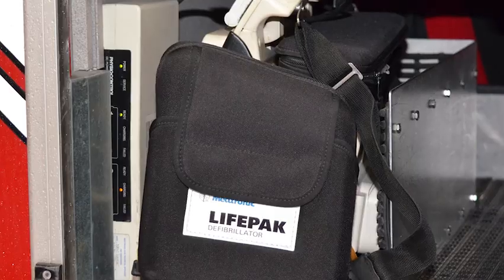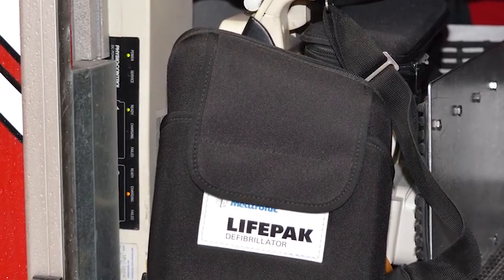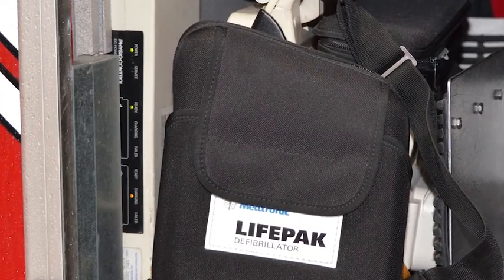Now we're going to talk about the batteries for the LIFEPAK 15 and the charging unit. I'll show you in just a little bit what the desktop charging unit looks like that will be located at all the stations. One of the things that will be a change for us is doing away with the onboard charging systems that we're so used to. A number of our neighboring agencies, including King County Medic 1, currently use the lithium-ion batteries on the LIFEPAK 15 that allow for longer charging period of time and a longer use period of time.